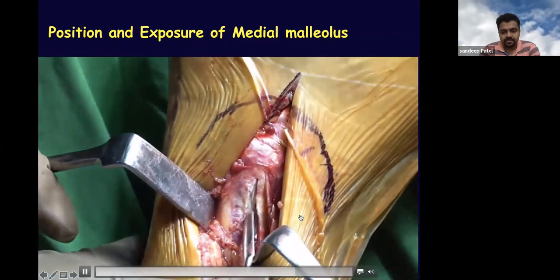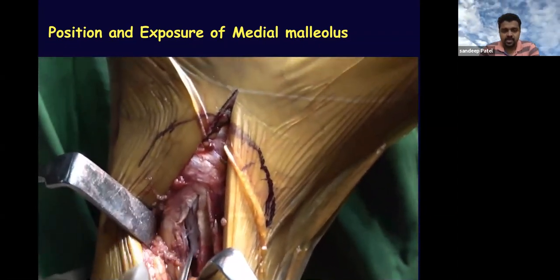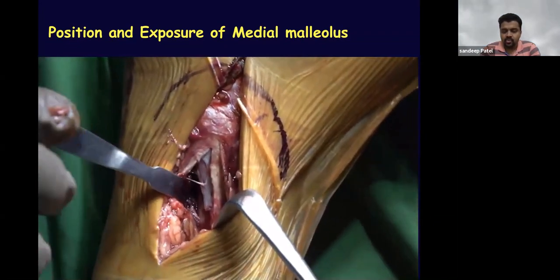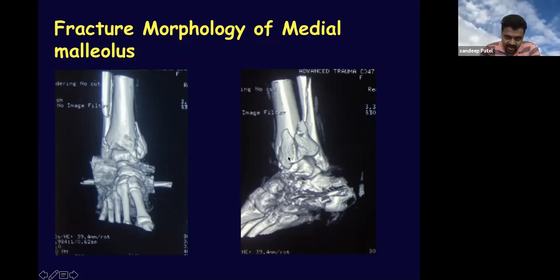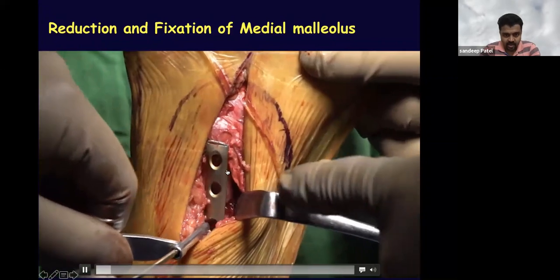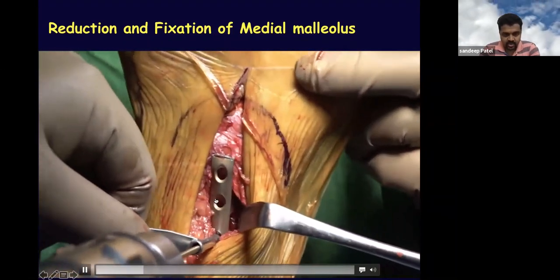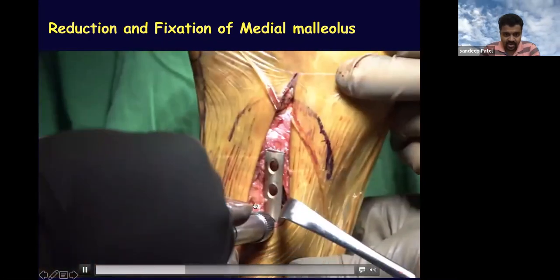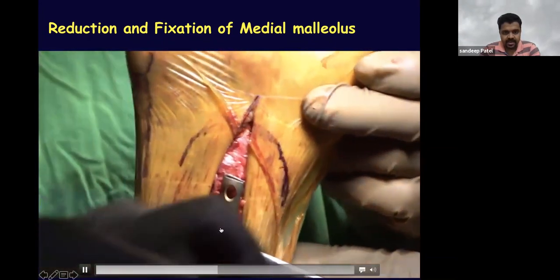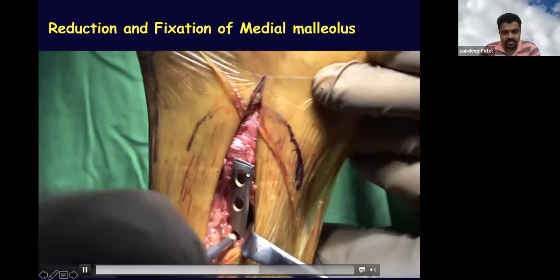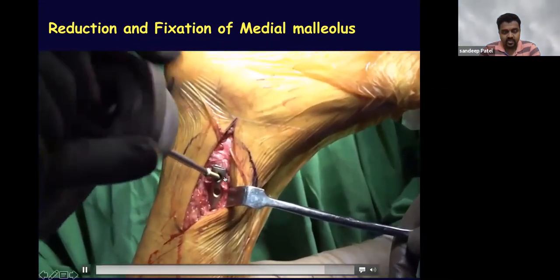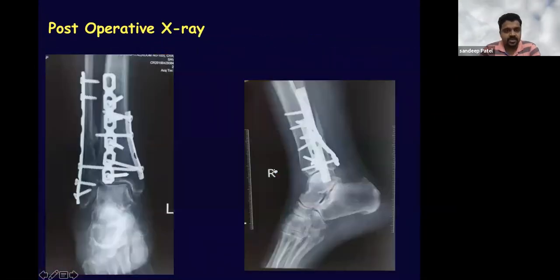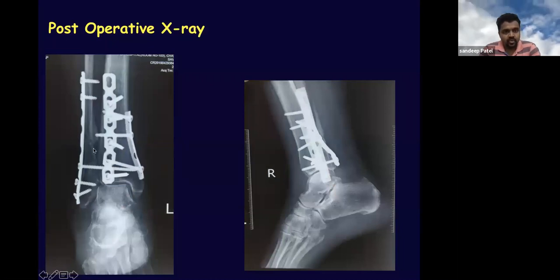Once the fracture is exposed, we achieve reduction and plan fixation. From the CT scan, we knew the fracture was more vertical in nature, requiring a buttressing plate rather than traditional medial malleolus screws. We chose a one-third tubular plate in anti-glide mode: drilled, checked, and applied the screw. On final tightening, the fracture pattern reduces. A screw is then applied through the distal fragment and through the plate to stabilize the medial malleolar fracture. Final follow-up X-rays show the construct, including a syndesmotic screw required for this PER injury.